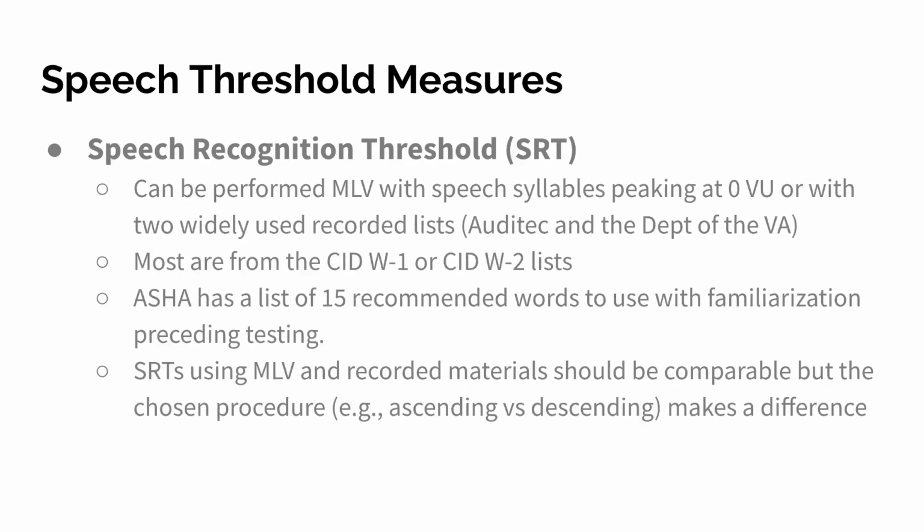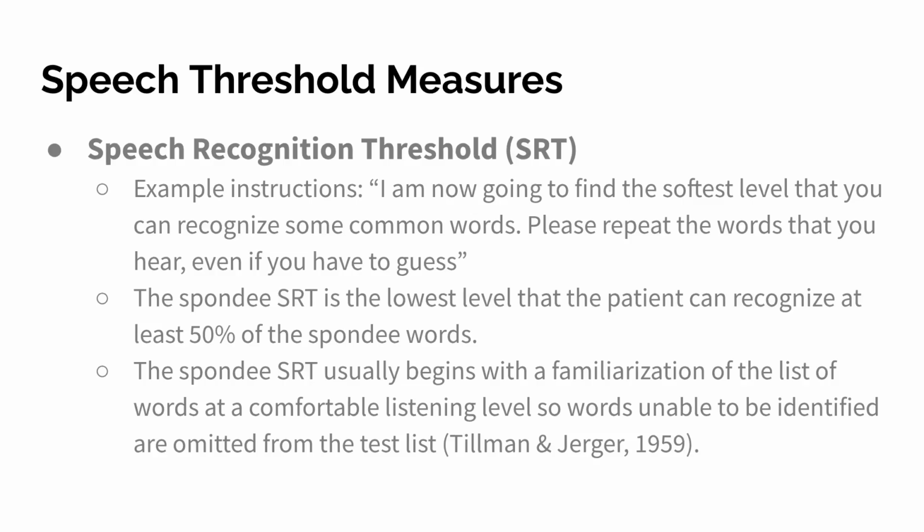And SRTs using monitored live voice and recorded materials should be comparable, but the chosen procedure, ascending versus descending, makes a difference. Here's another set of example instructions. I guess I've got 2 sets of examples. I'm now going to find the softest level that you can recognize some common words. Please repeat the words that you hear, even if you have to guess. So just another set of instructions you can use.